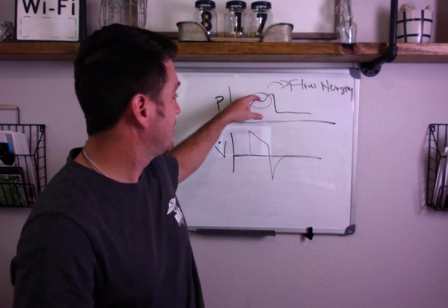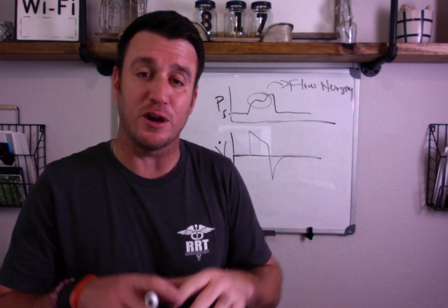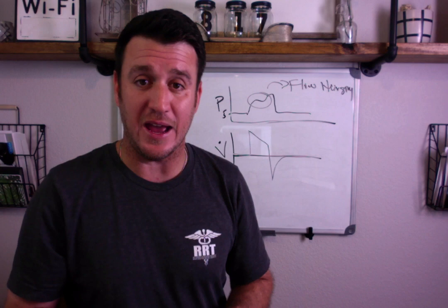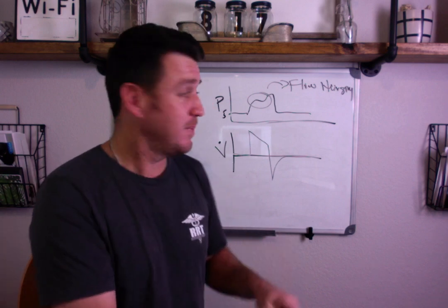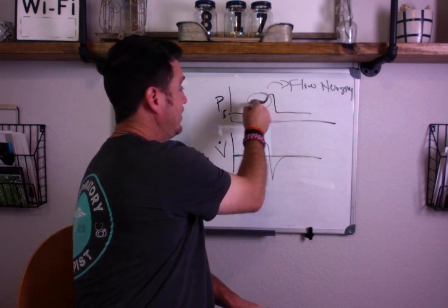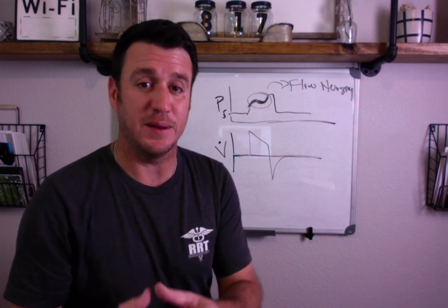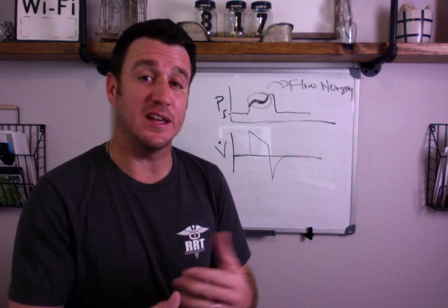Why does the pressure waveform dip? Well, it dips because the patient's diaphragm is dropping faster than the flow of gas coming into the lungs. If the diaphragm drops quicker than that, then you get a greater drop in intrathoracic pressure, which pulls this pressure down, and you get this dip, okay? And that is an indication of an inadequate flow. This patient is flow hungry, okay? So in this case, you need to increase the flow.